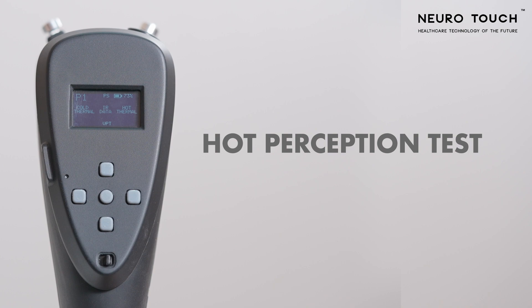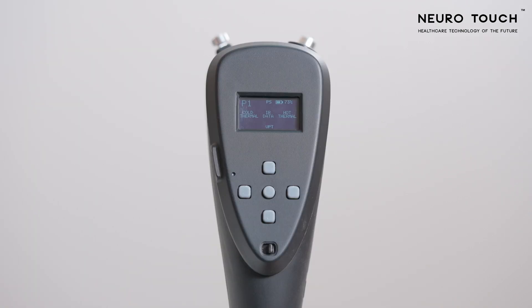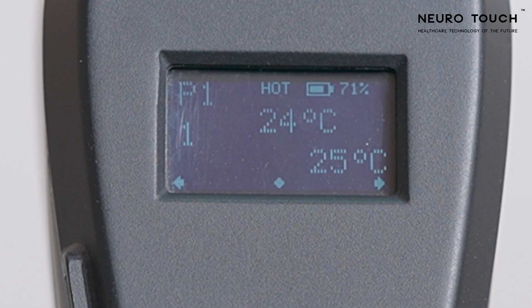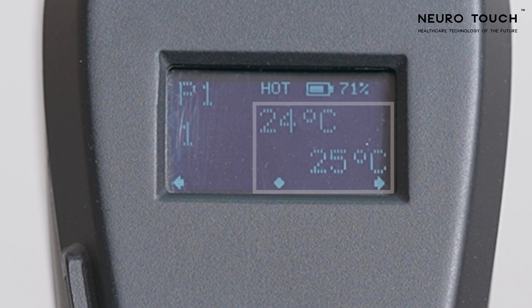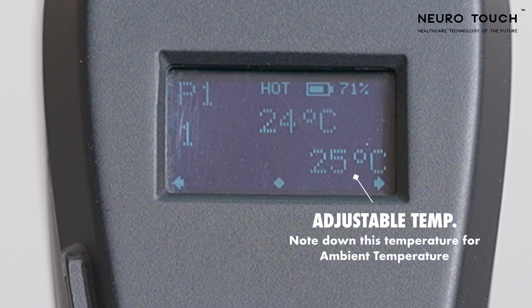Hot Perception Test. We will begin the screening with the hot perception test. Click the right key to start the hot perception test. You can see the test point number on the left with two temperatures in the middle of the screen. The temperature displayed at the center indicates the temperature of the probe, while the temperature displayed below indicates the temperature that you can set the probe to.